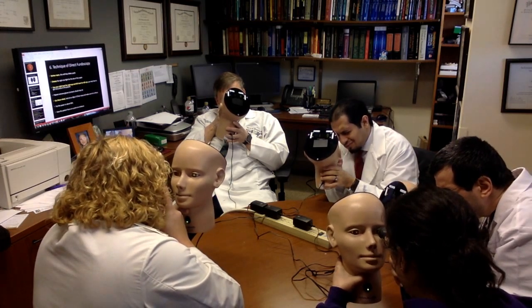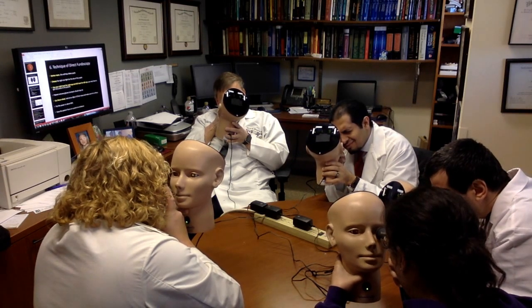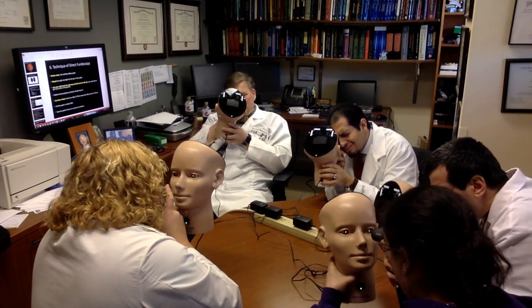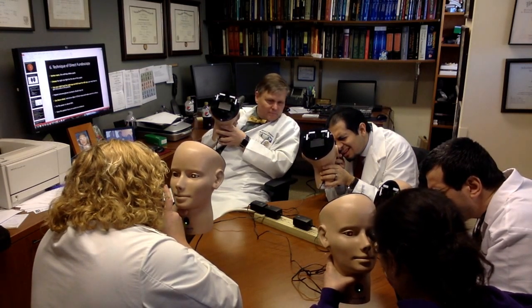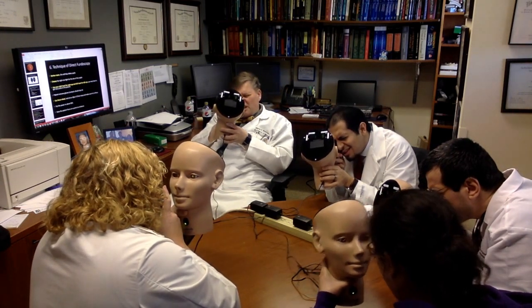Okay? Part of this exercise, you have to tell me the truth, which means if you see something or don't see something, you've got to tell me. Does everyone see the retina yet? And can you see the disc? Yes. See the disc? Not yet. See the disc? Yes. See the disc? Yes. Okay.